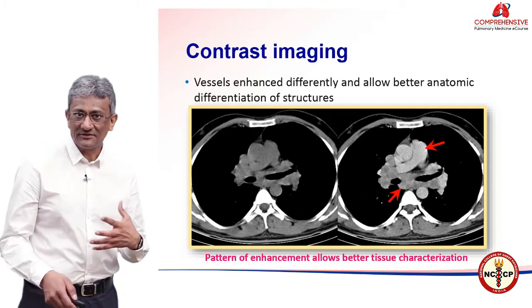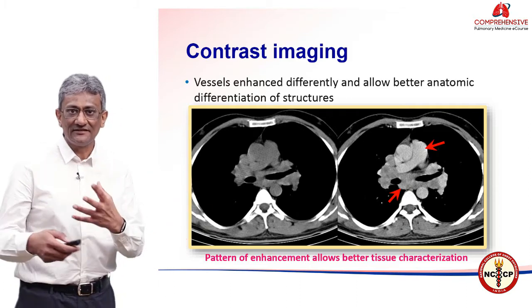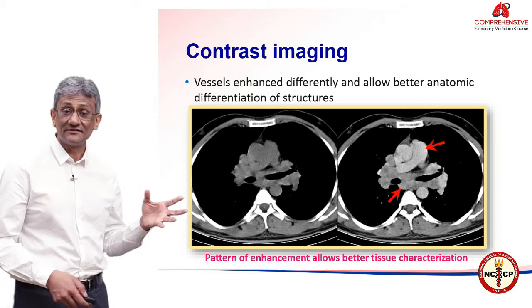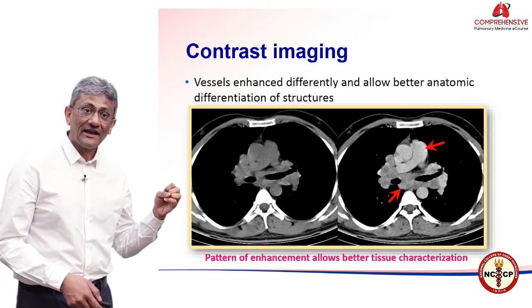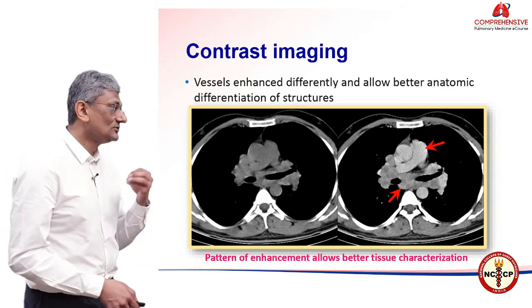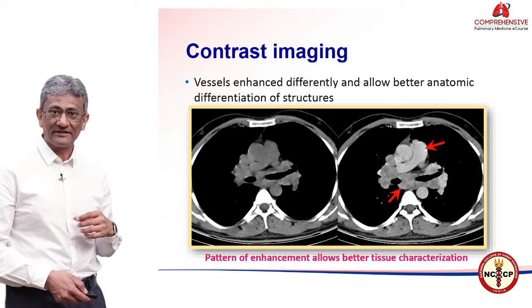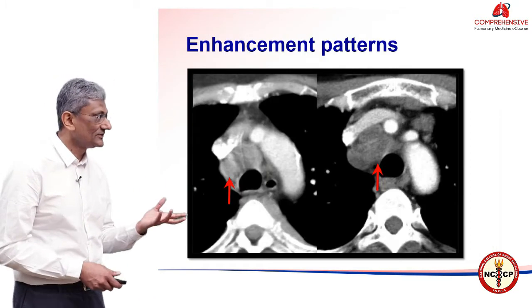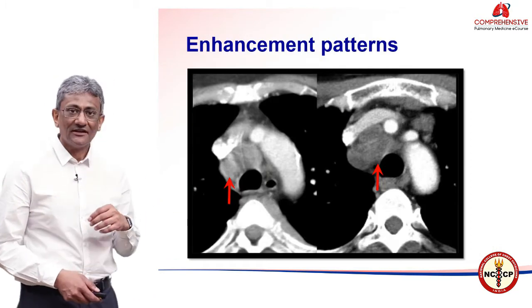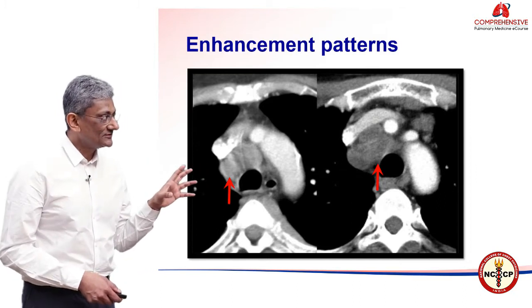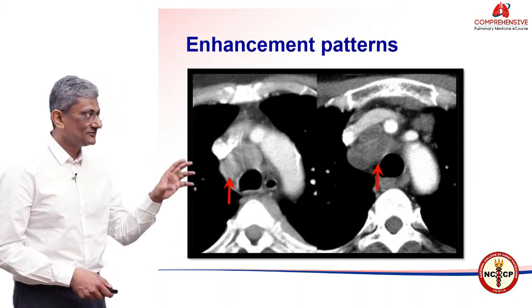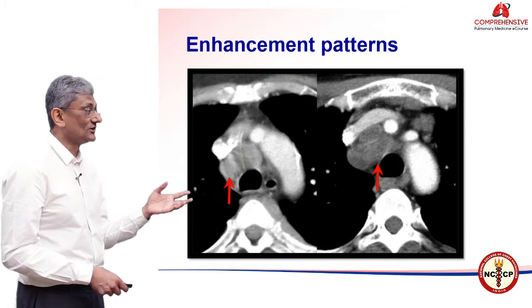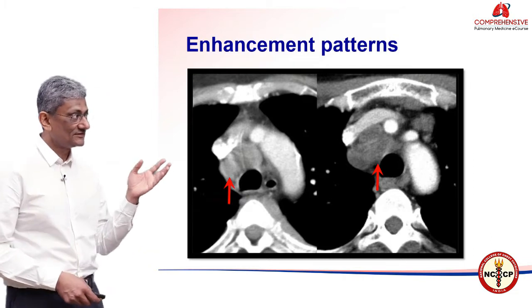The pattern of enhancement — whether these are nodules in the lungs or lymph nodes — the patterns are different, and that also allows us some form of better tissue characterization. For example, the lymph node in the paratracheal region on the left shows homogeneous enhancement, which means it is non-necrotic.